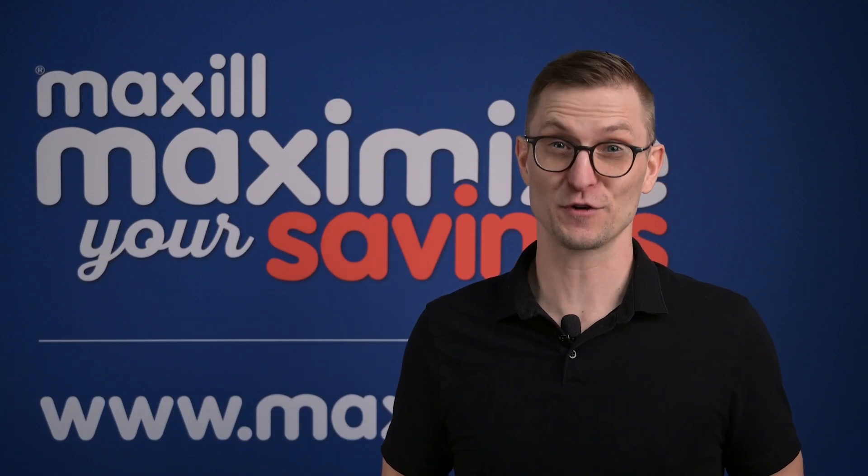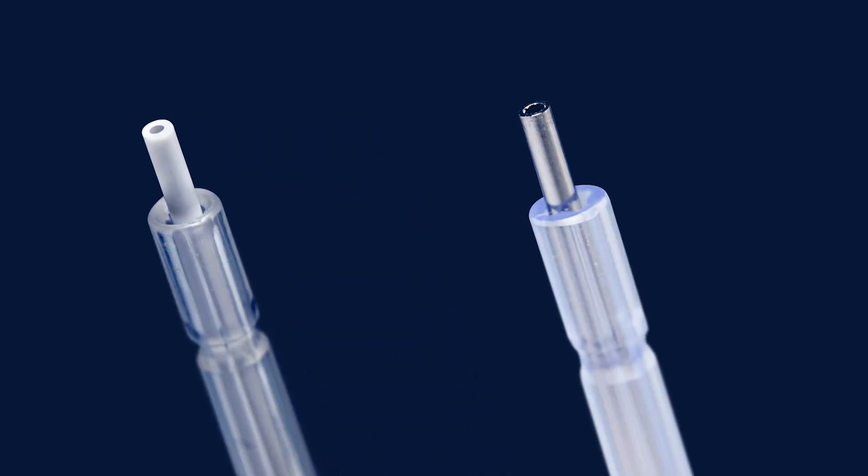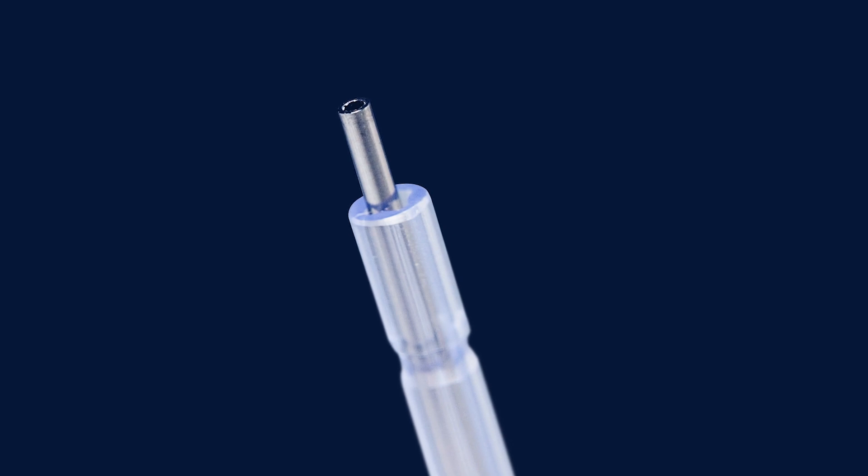Now with the versatility of two different core options: standard plastic core and the premium metal core. The metal core provides added strength for retraction, catering to the diverse needs of dental clinicians.